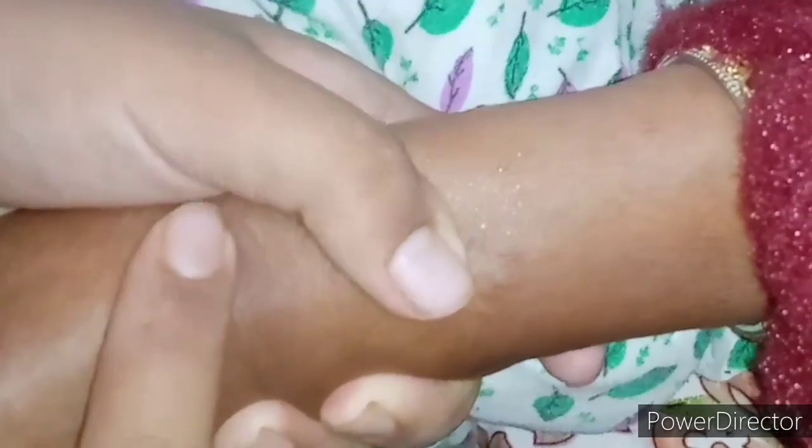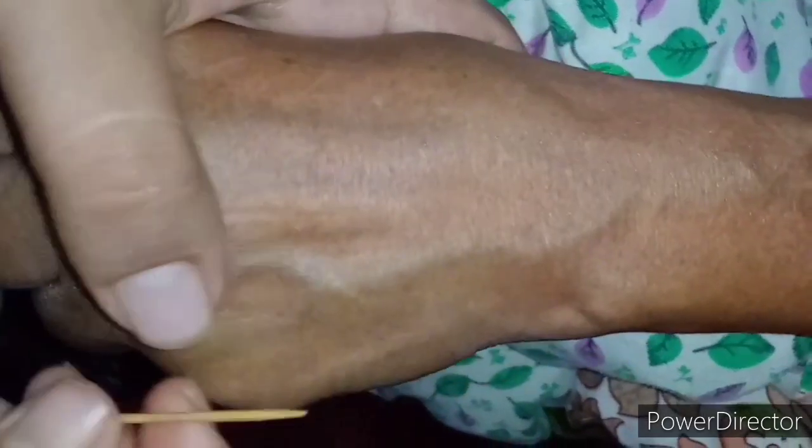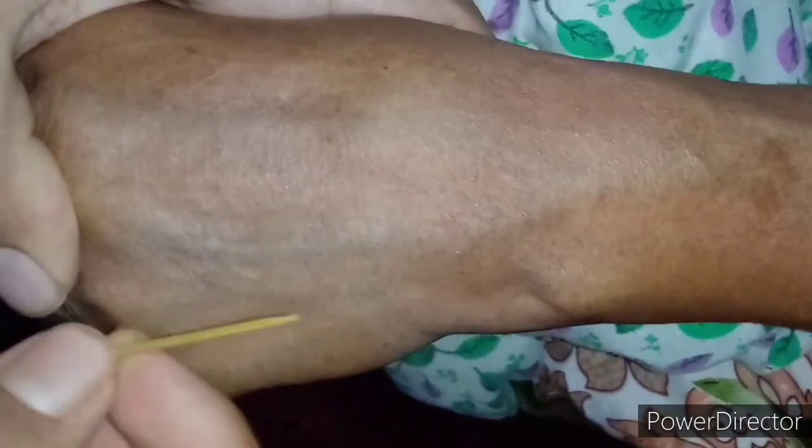You have to stabilize the vein before doing IV cannulation. Let's suppose this is our cannula. When the vein is very superficial, the cannula should be inserted almost parallel to the skin, not at a steep angle.